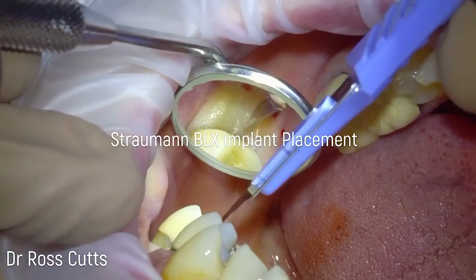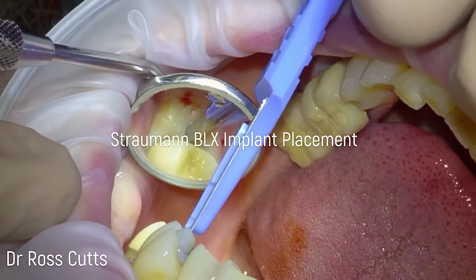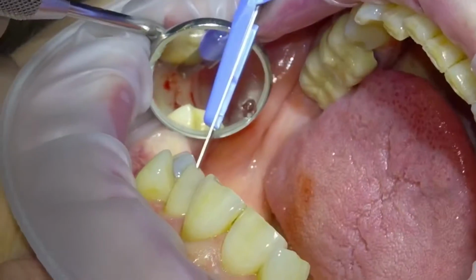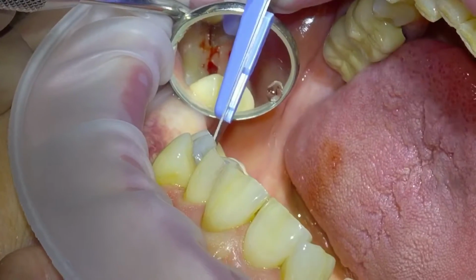Hi, my name's Dr. Ross Cutts and you're watching my video of me placing a Straumann BLX implant in the upper left 6 region using a small Summers technique.